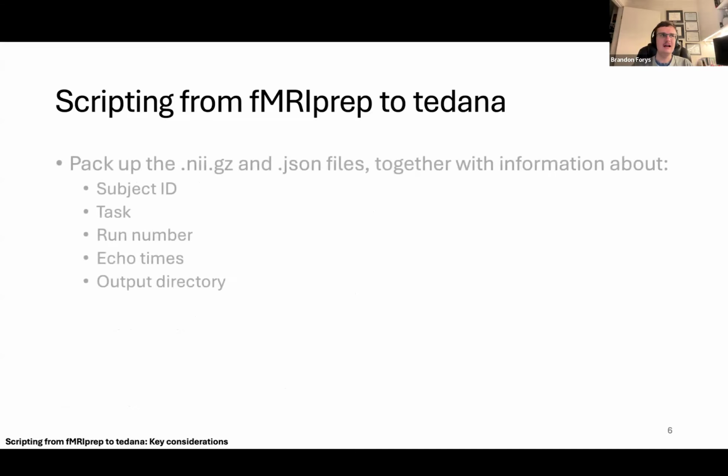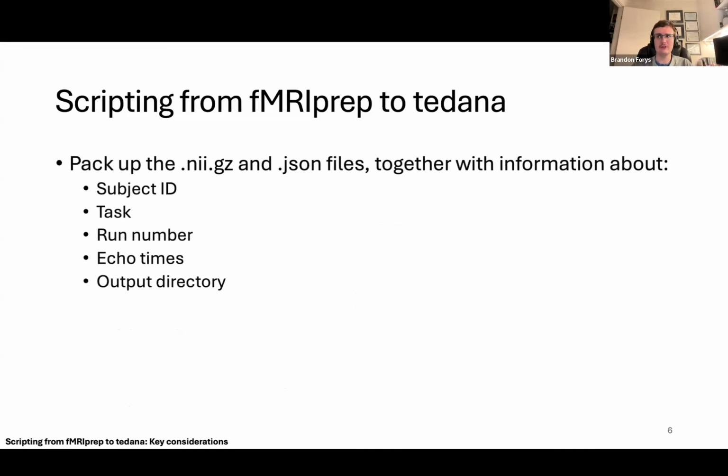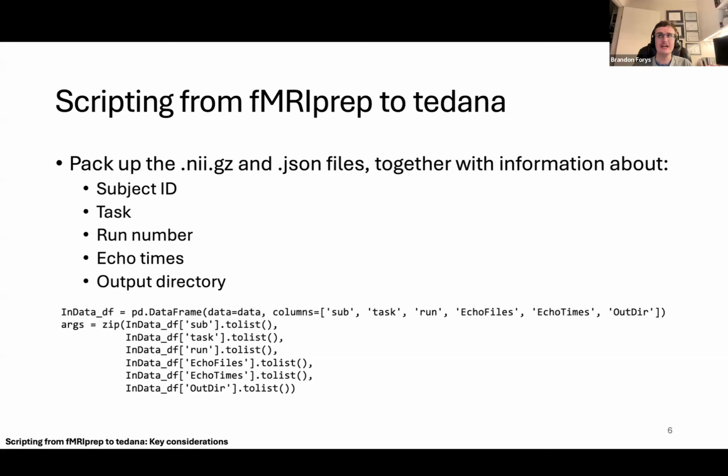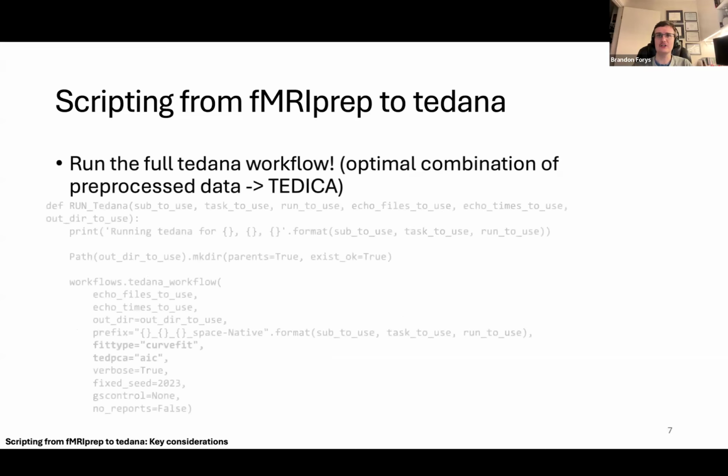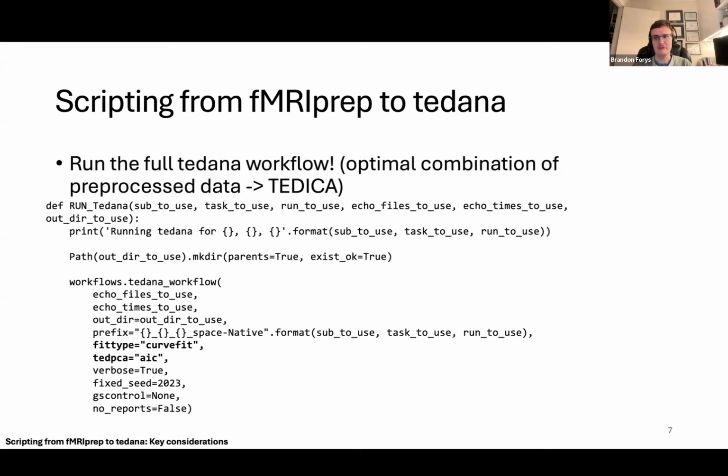And then I found it was relatively straightforward using that script to pack up the NIfTI and JSON files together into a zipped format, like so, to package everything together and send it over for the preprocessing using the tedana workflow functionality. And within our group at UBC, we have had some discussions as we were trying to determine which of these options are the best to use.